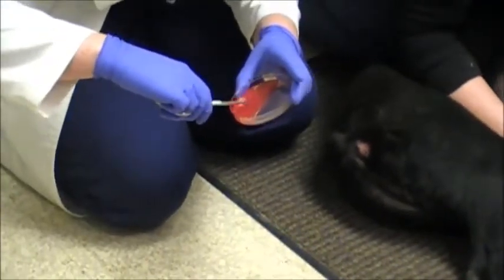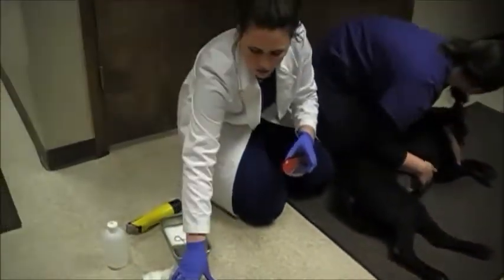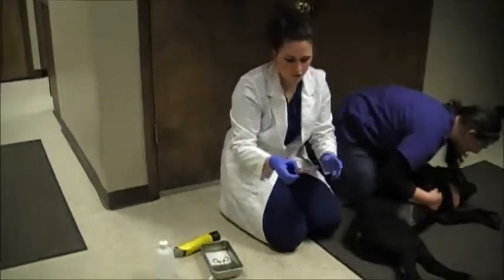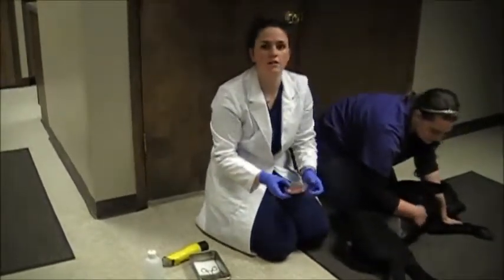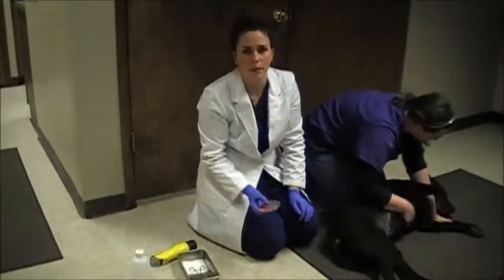Now my DTM medium is just going to incubate at room temperature. I'm going to leave the cap on loose — I'm not going to put it on tight. And it can incubate for up to 7 to 10 days. I'm going to check it every day for growth, and at the first sign of growth we'll be able to put it on a microscope and examine it from there.